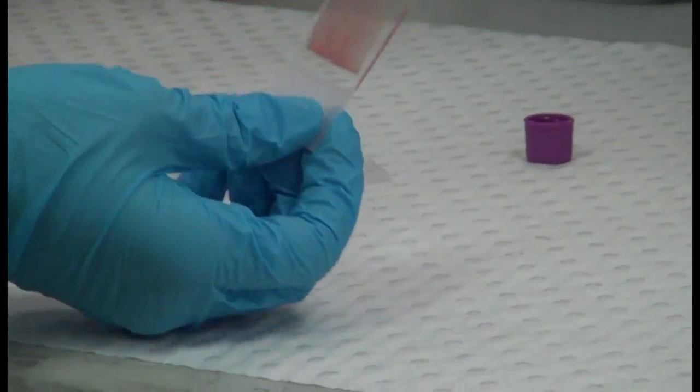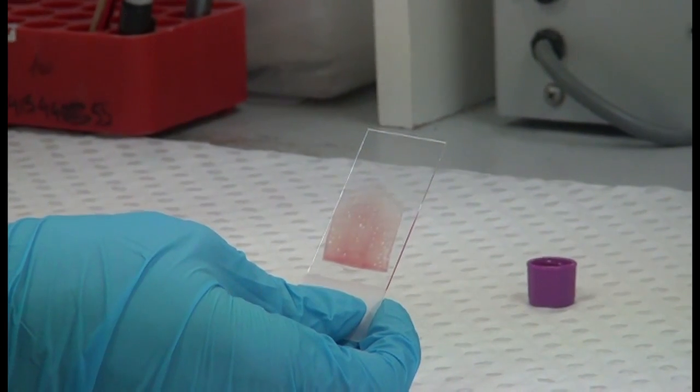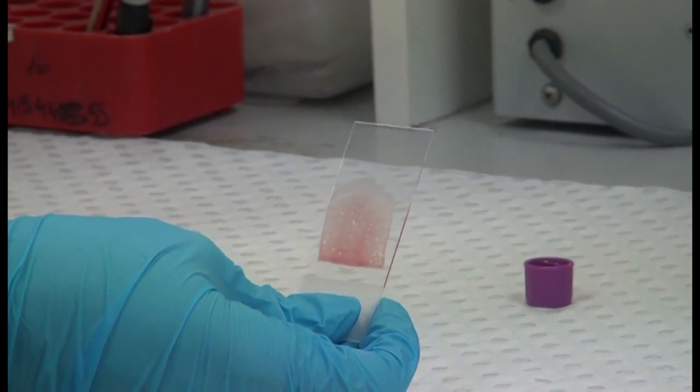And then you've got a nice smear — it's got a feathered edge and ends about halfway up the side of the slide. And that's how you make a blood film.